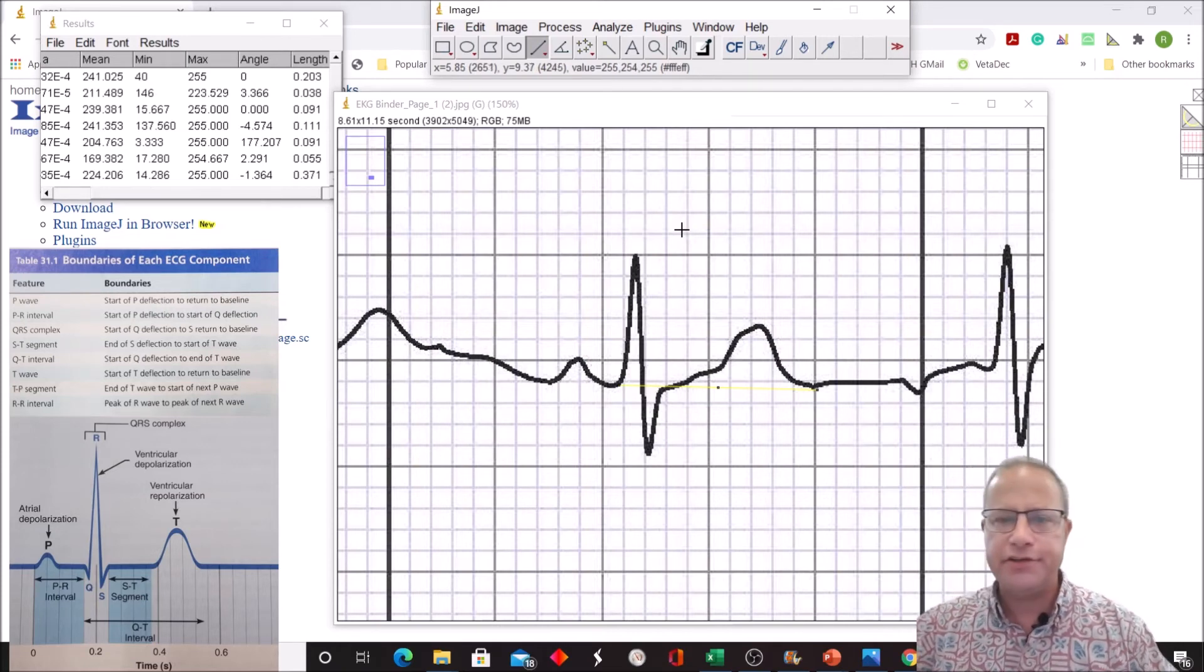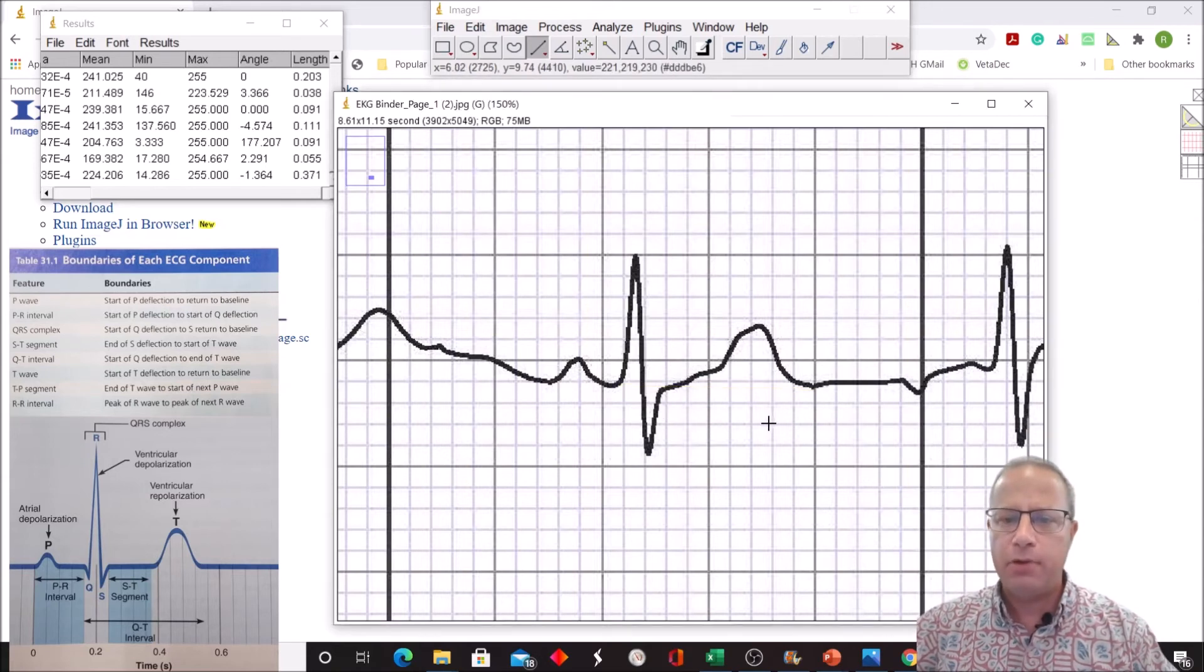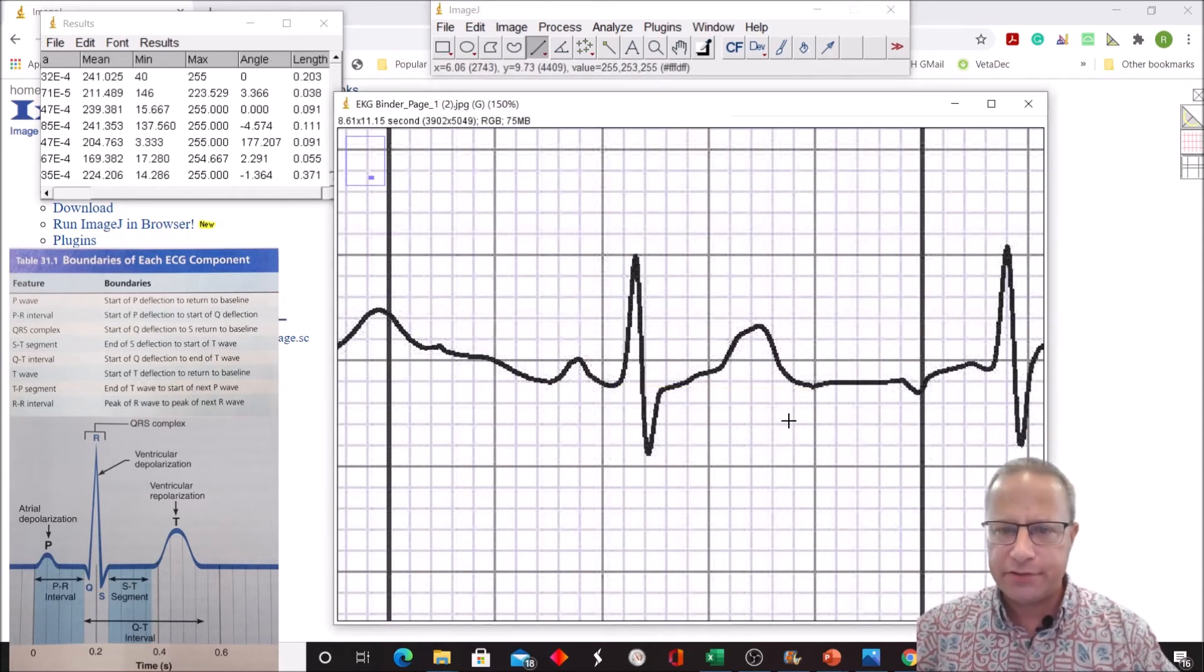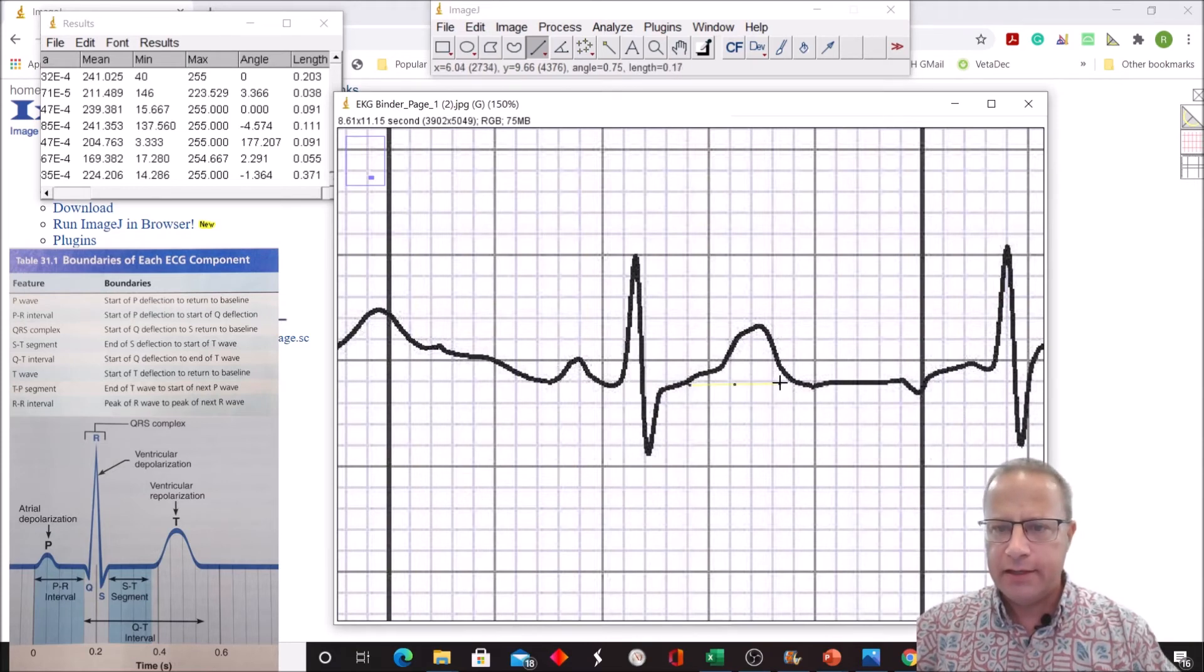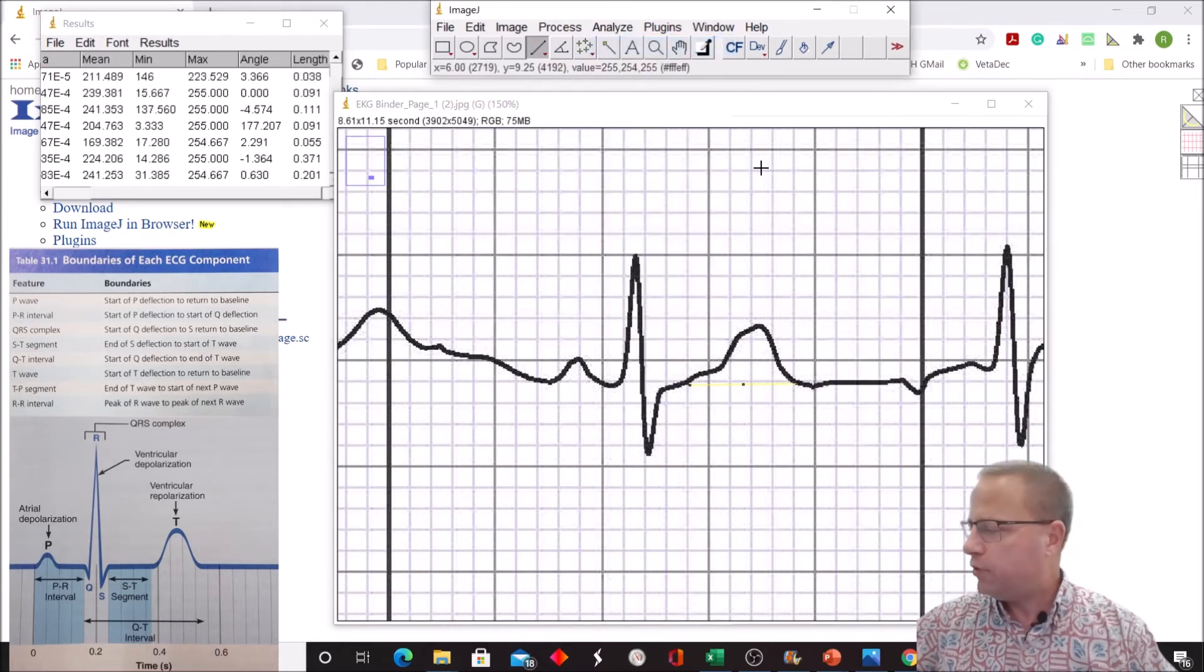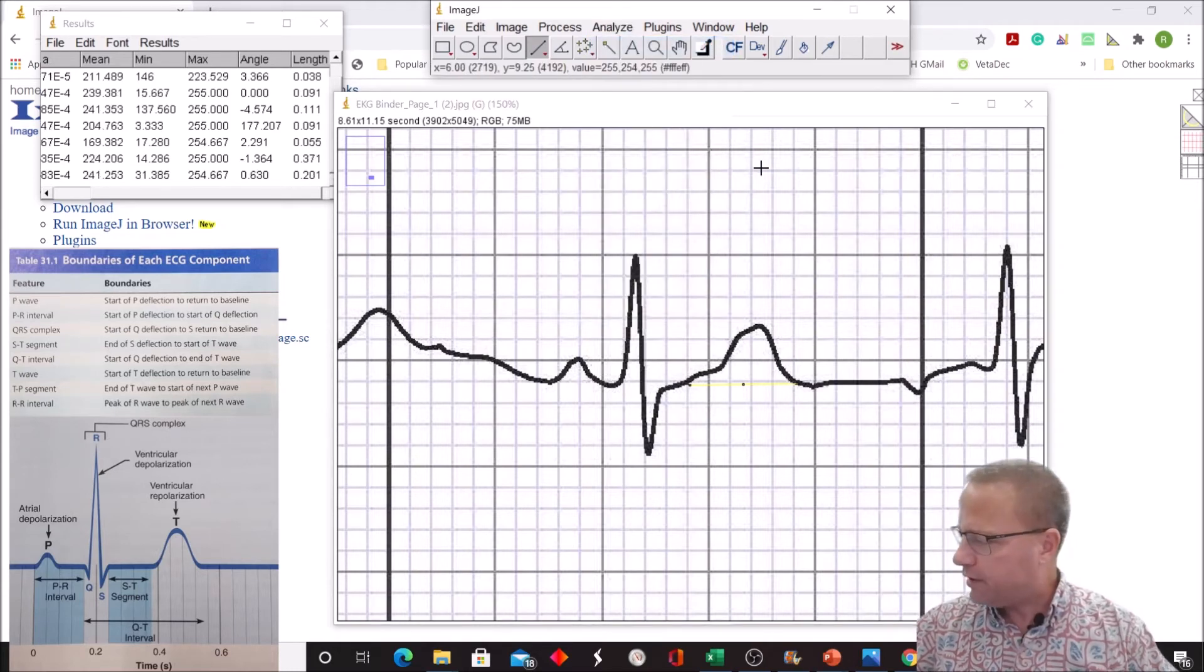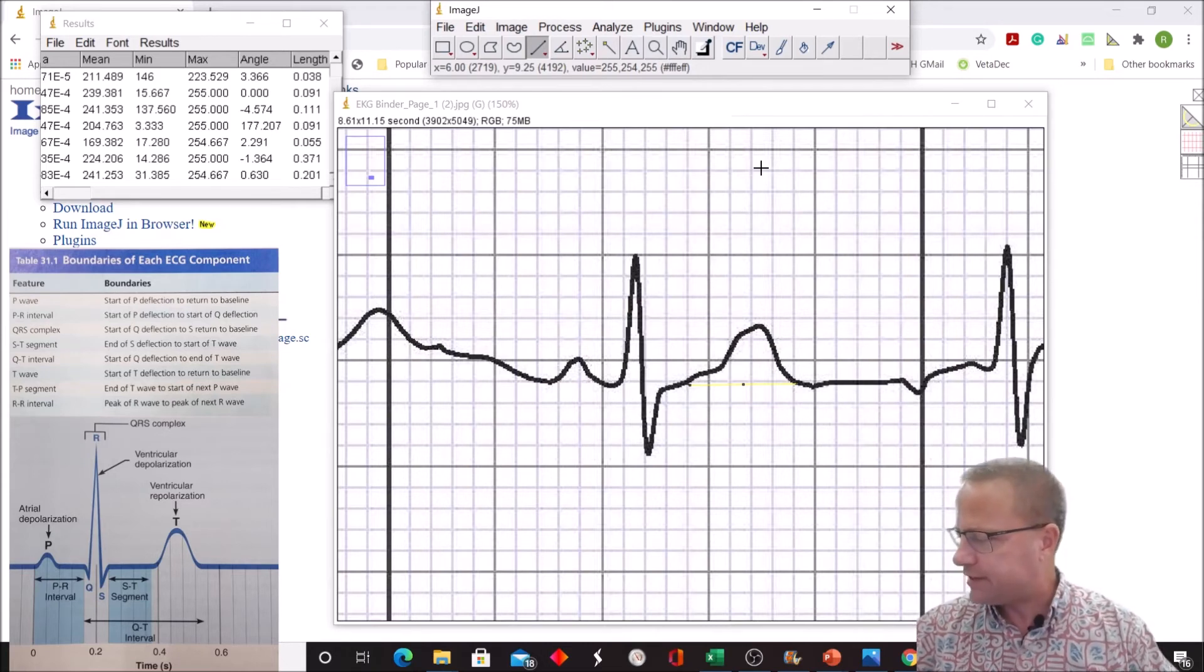Now let's look at our T-wave. T-wave represents repolarization of the ventricles. We're going to say T-wave begins maybe right about there and ends right about there. Analyze, measure, 0.201. The range here is somewhere between 0.10 and 0.25, so that's fine as well.